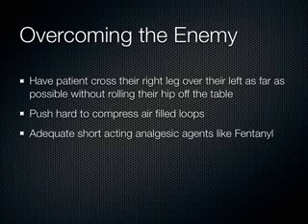People say ultrasound is a very operator-dependent thing. Some people are good at finding the appendix, some people aren't. No. Appendicitis is a very fentanyl-dependent thing. You guys know what fentanyl is, a narcotic, short-acting, lasts 20 minutes. We use it a lot in patients who have acute pain in the emergency department. I can give somebody a good slug of fentanyl, and it really does take the edge off their pain so that I can compress and get into their abdomen using ultrasound.